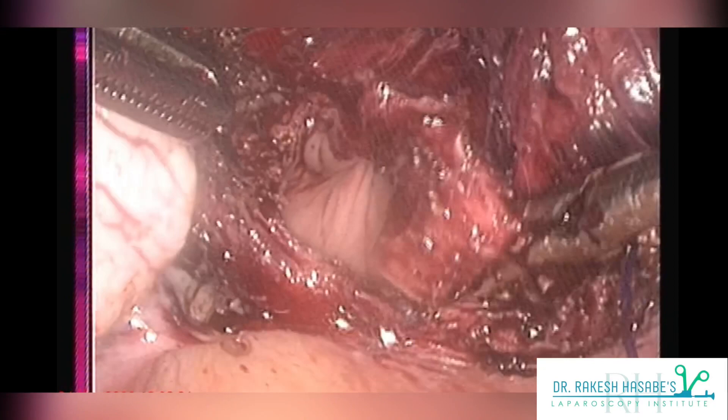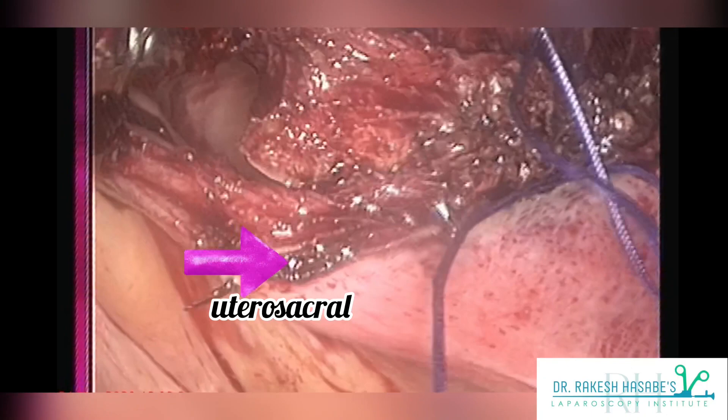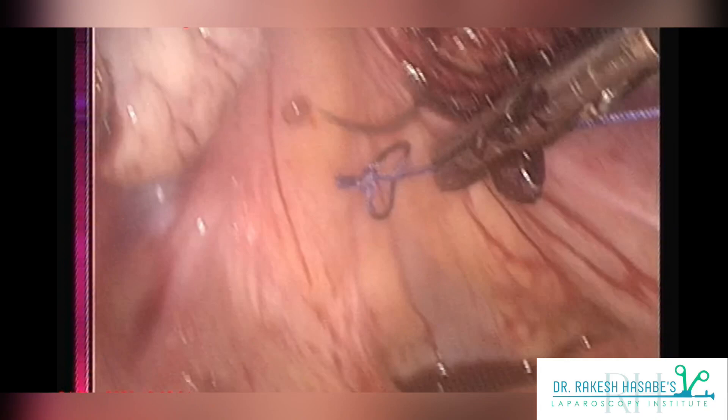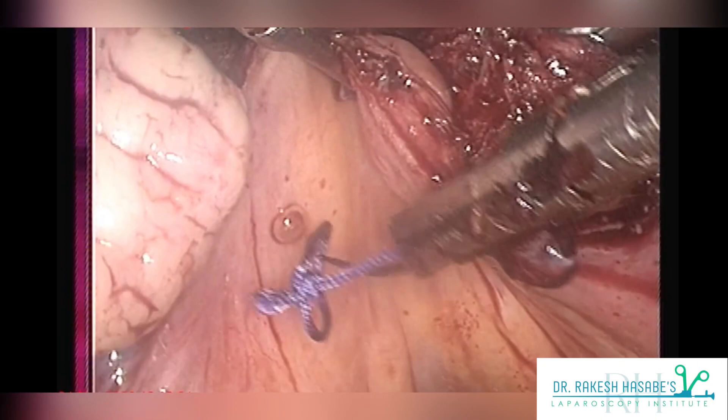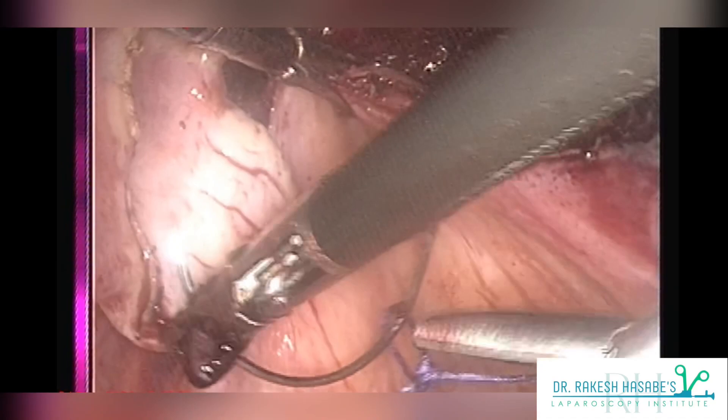Now let's start the actual vault closure. Lift your anterior vault using your grasper, or ask your assistant to help, and take a good bite using your needle. Here I am performing a vault closure using simple Vicryl 1-0. V-lock or Quill is also a popular suture for laparoscopic vault closure. You can see I have already asked my assistant to put a knot and form a loop at the end of my Vicryl, just as in the case of V-lock, which will save time and is equally effective.